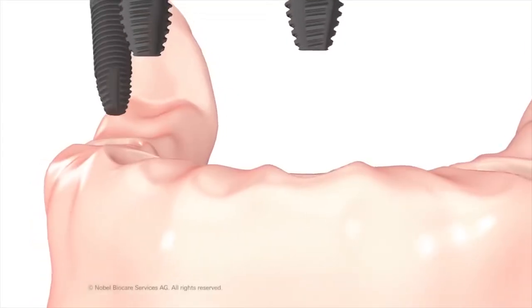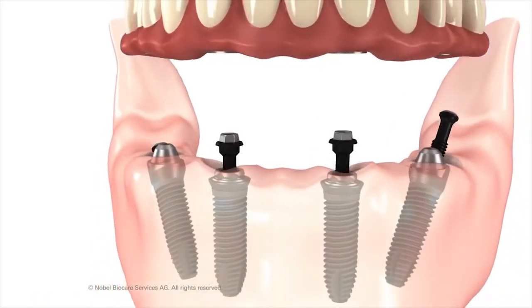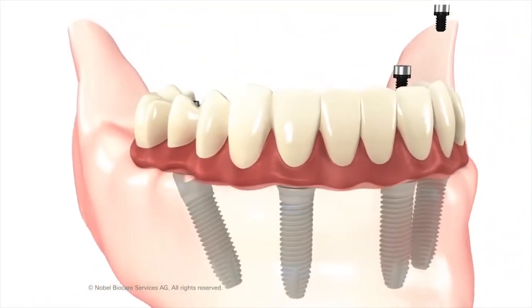Sometimes it's called the all-on-four, sometimes it's called smile in a day, sometimes it's called teeth express — there are a lot of different names for it. But the concept is that there are a lot of people who are just missing all of their teeth, and the all-on-four procedure is a way to replace all the missing teeth in one or both jaws.